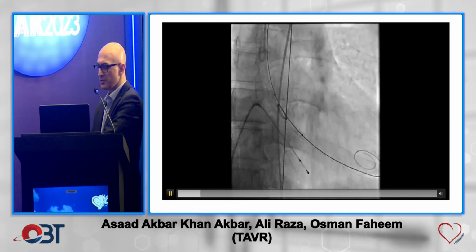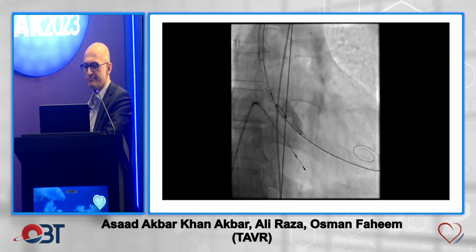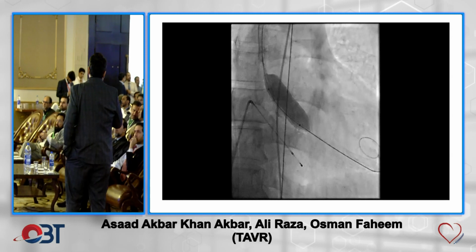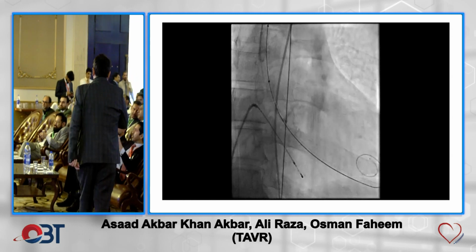So we did decide to do a BAV, and so Ali, with bicuspids do you always do a BAV? Always. That's a mandatory thing for the bicuspid for me, because I do not want to post-dilate bicuspids too much. I go for higher implants at times, and I don't want it to pop up out.